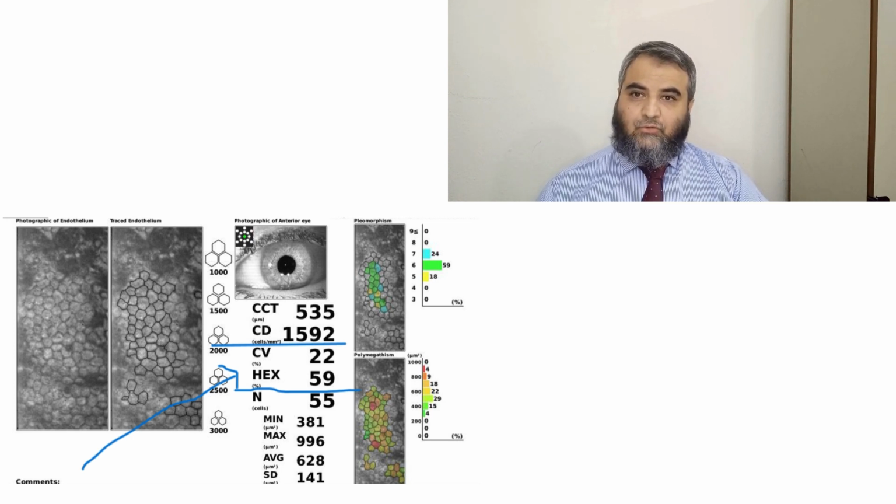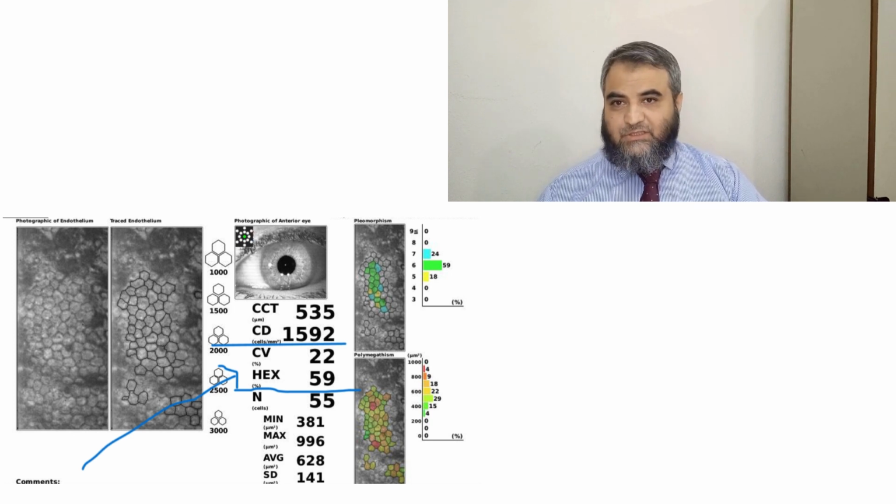So this was the point I wanted to discuss with my respected audience today about the management of cataract surgery in low endothelial cell count and the importance of specular microscopy in cataract surgery.